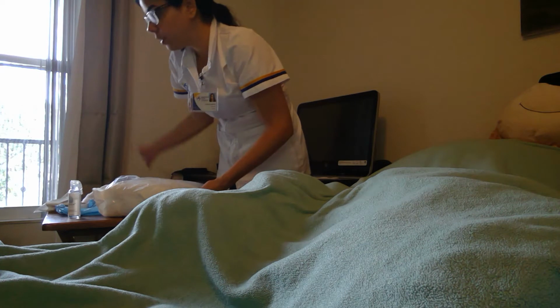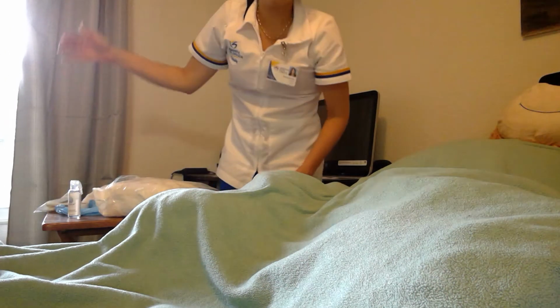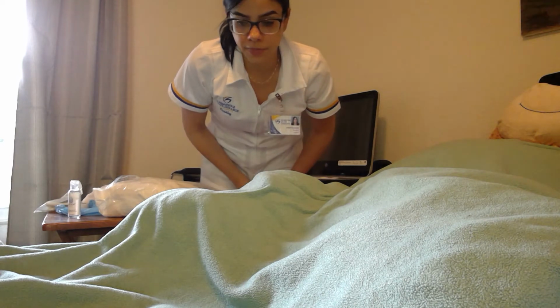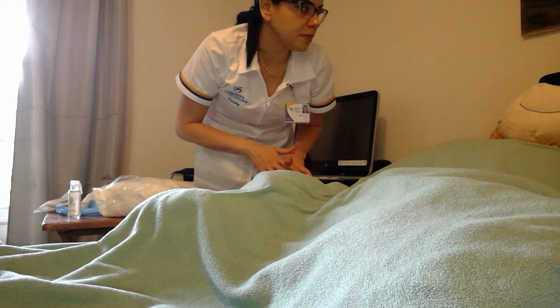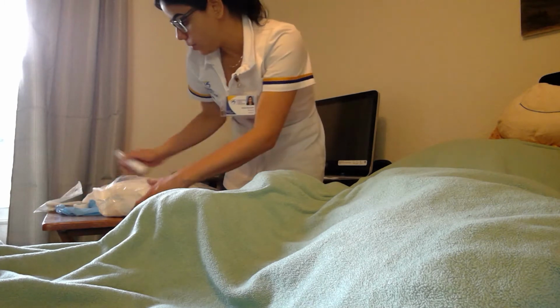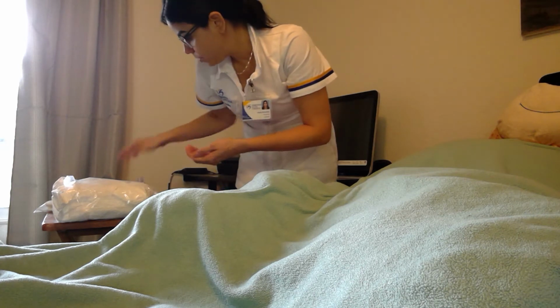Okay, I'm gonna close the curtain. This is the curtain. I'm gonna close it, and I'm gonna close the door for privacy. Okay, so once we've done all of that and she feels comfortable with it, I am going to perform some hand hygiene, and I'm gonna put my procedure gloves on.